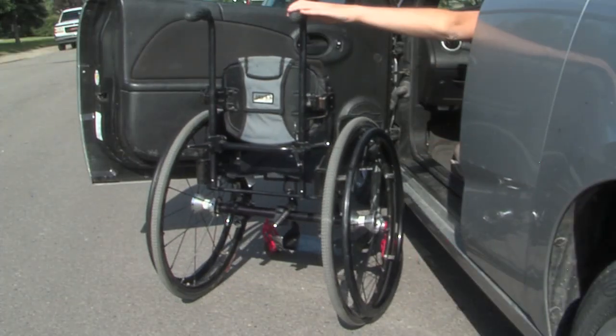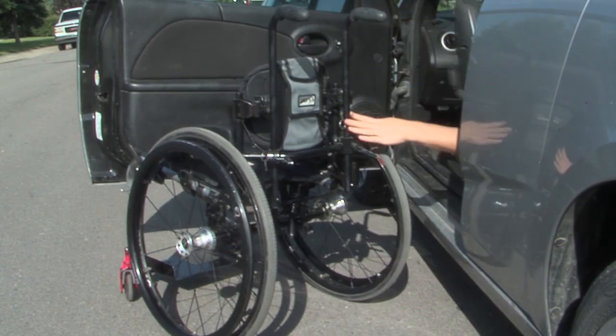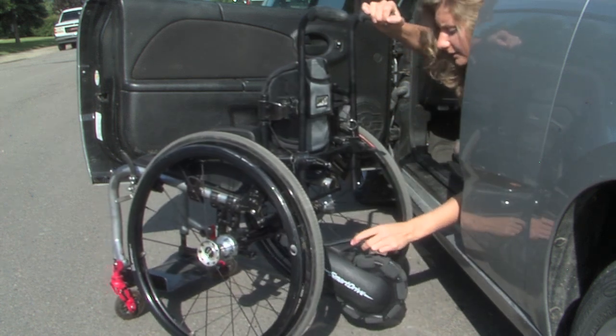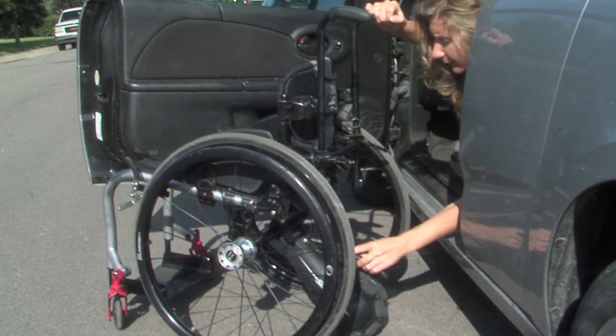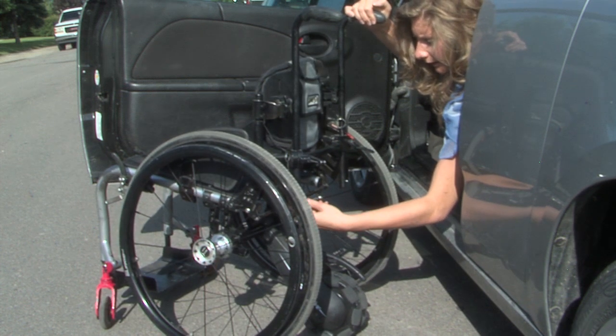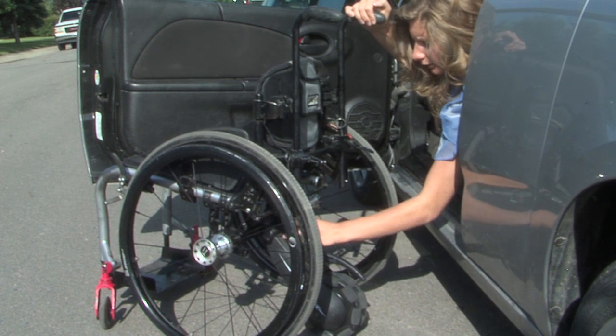After I put my battery pack on my seat sling, I just grab my smart wheel and click it into the bracket that was attached to my wheelchair, and then you just plug in your cord.